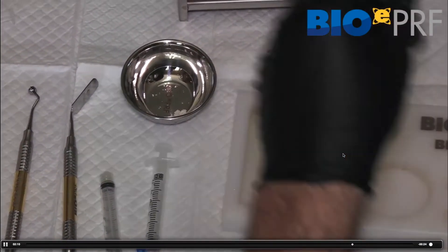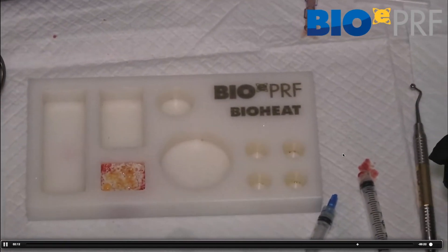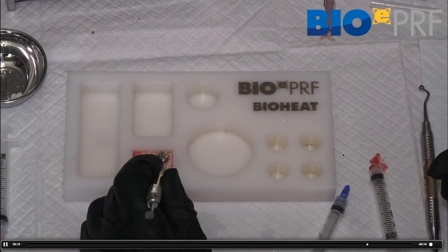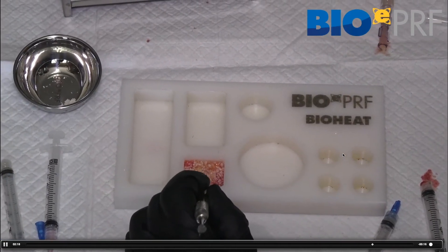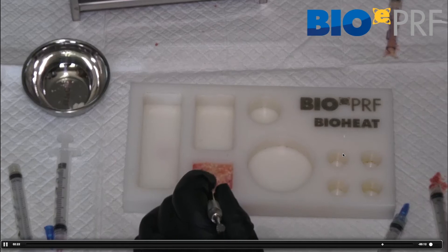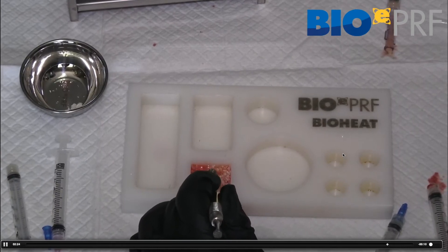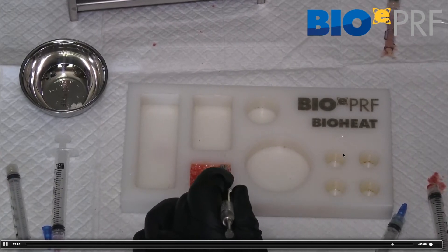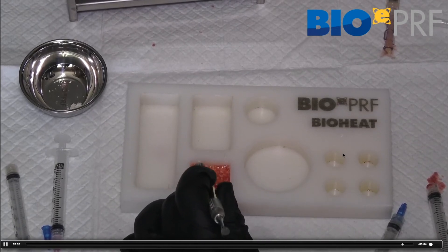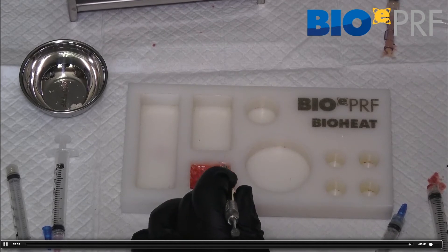Make sure you get enough liquid PRF in there, compact it down, make sure all the allografts are soaked in there, and then we'll go over what it looks like at the very end. The advantage is the base of this is the EPRF membrane, and at the top what you see is the sticky bone being formed.